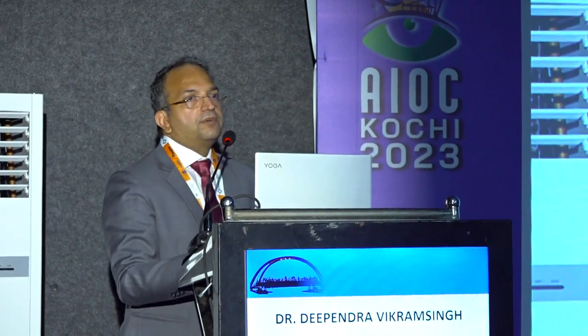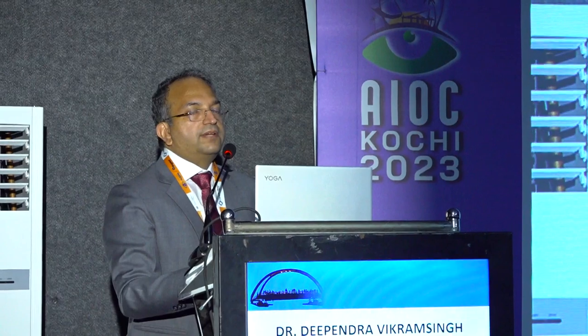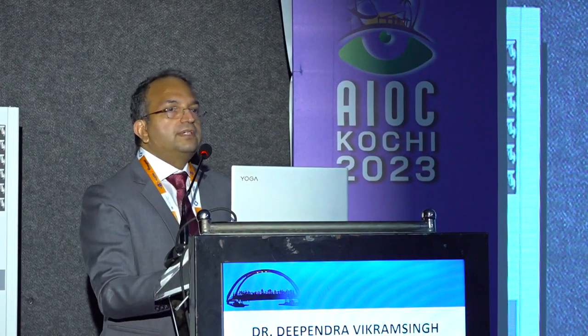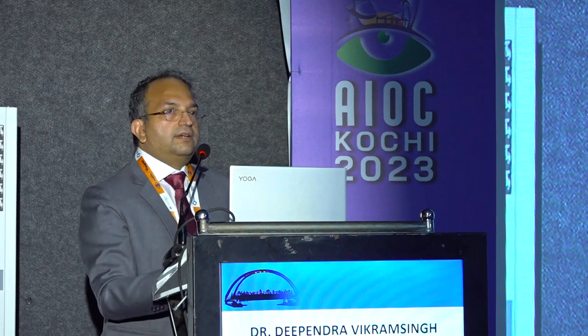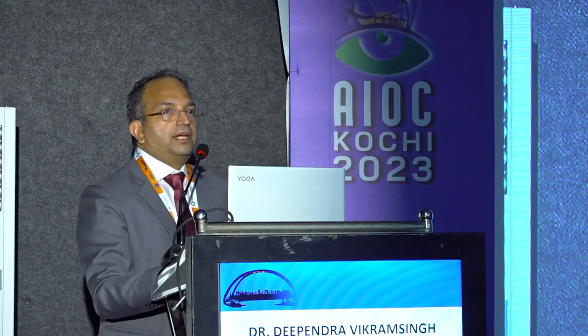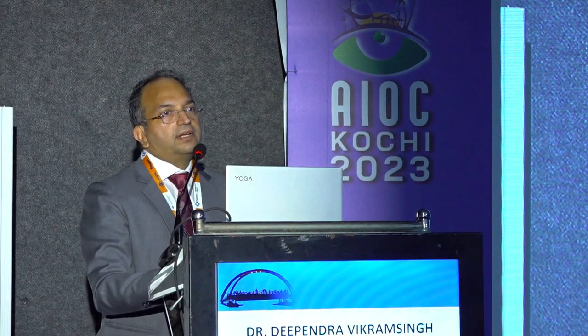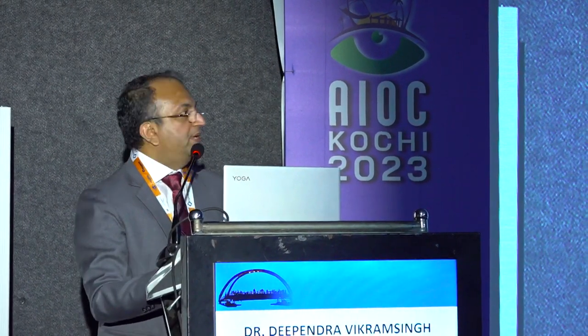In the interest of time, I have not shown how shifting works, maybe in my next presentation I'll show that you have to shift your hands. Sometimes you have to shift from right to left and left to right. You can shift your ports also. I think surgeons have to improvise when we are doing PDR surgeries. Maybe Dr. Reddy can.